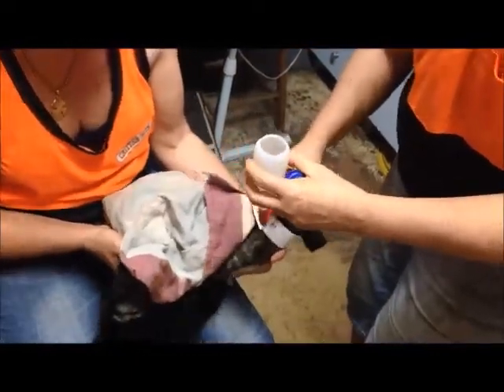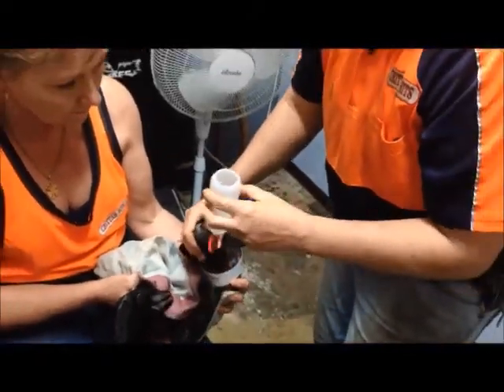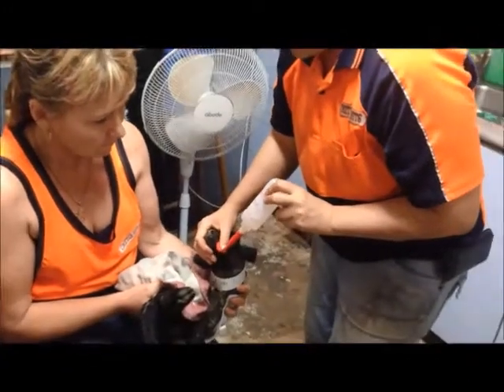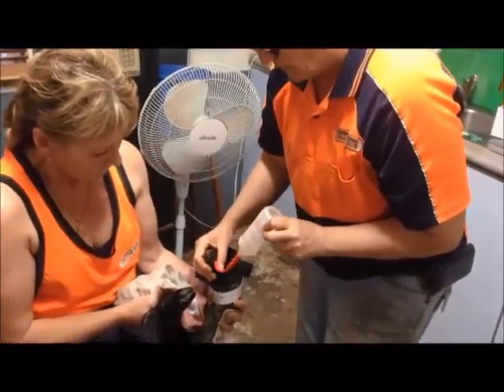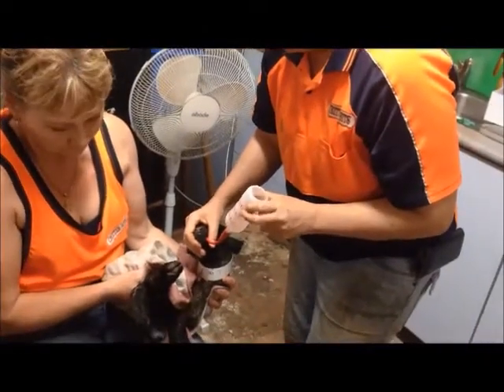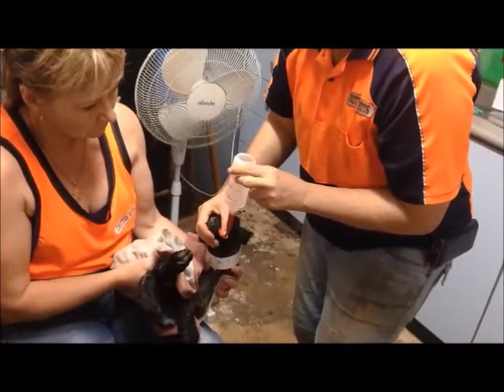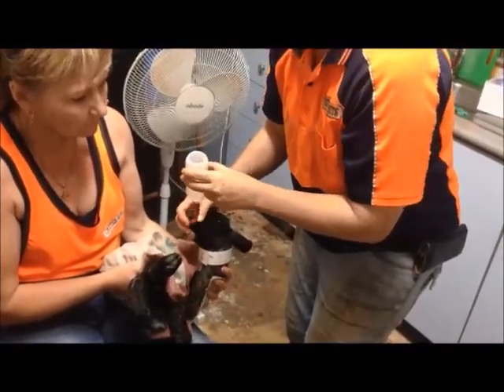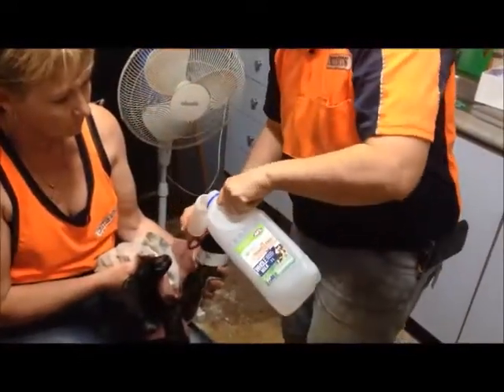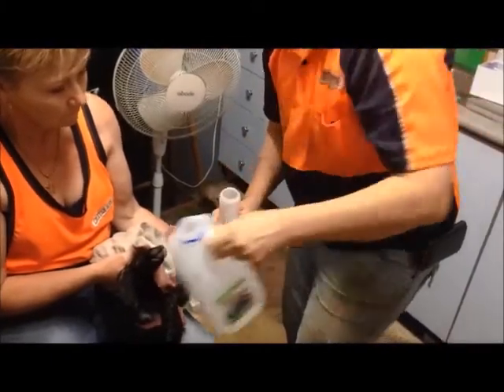They're exceptionally healthy now and happy, and it just gives them that boost to keep them going. Now we're down to about 30 mils — so 90 mils has gone in — and this will make this lamb feel a lot better. I'll put a little bit more in because it won't matter if the stomach's full; it just won't go in. So that's fine — just put another 60 in or something like that.